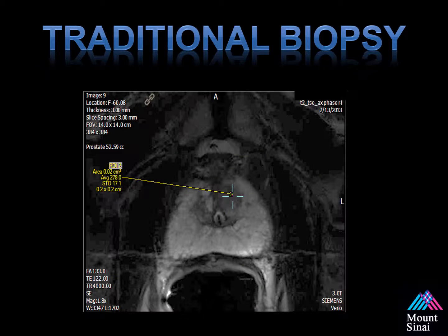This is an example of an axial T2-weighted image of a gentleman who had two prior negative prostate biopsies. If you look, there's an area on the anterior left portion of the screen that has a low signal intensity on T2-weighted imaging.